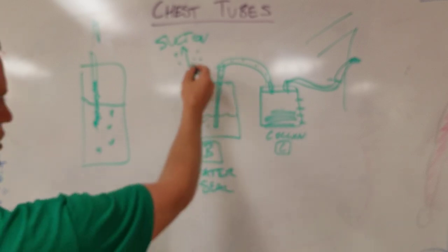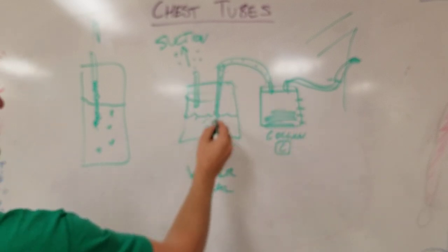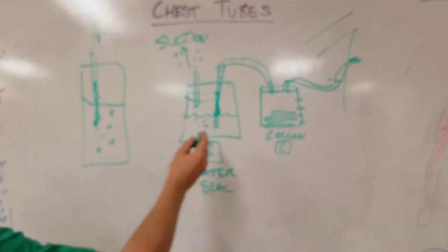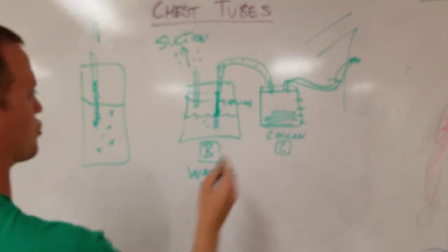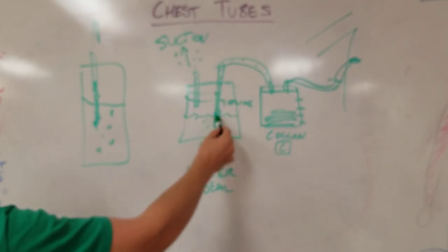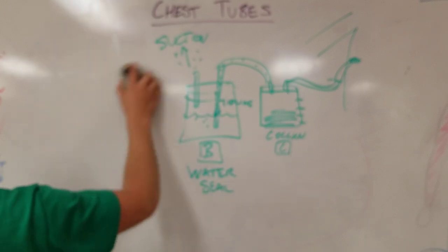And what that does is, when it's on suction, air can escape through. We've already taken care of the liquids, now we're taking care of the air, but no air can get back in, because if this patient inhaled, all that it's doing is raising up and down this water level, just like at the restaurant when you were a kid. This is called tidaling. In describing a functional chest tube, you might say, this patient's chest tube is tidaling, and what that means is you can see a fluid level moving with each breath somewhere on the pleurovac or in the chest tube. That means this chest tube is still patent, this system is still open and working, and that's what your Bravo chamber is.